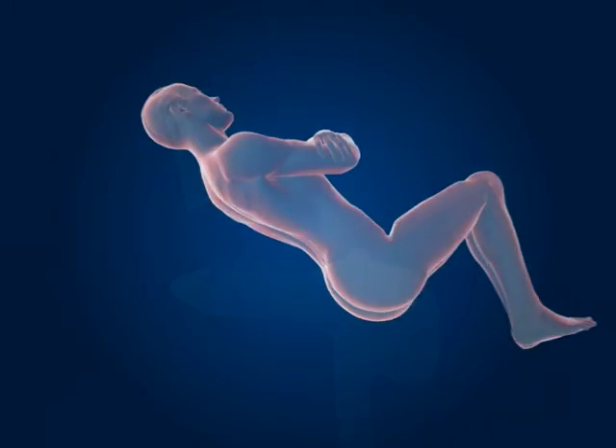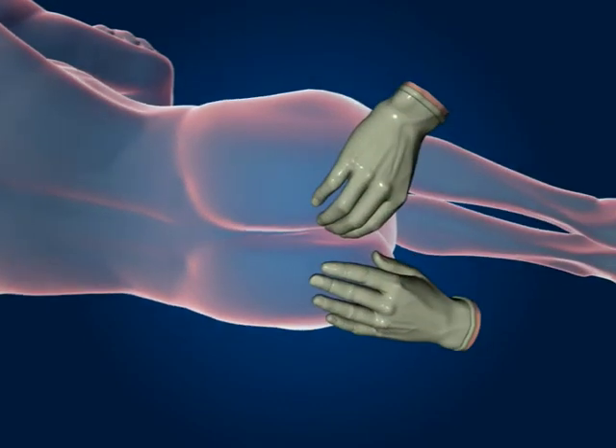Before introducing the instrument, perform a rectal examination to check for any tender areas.